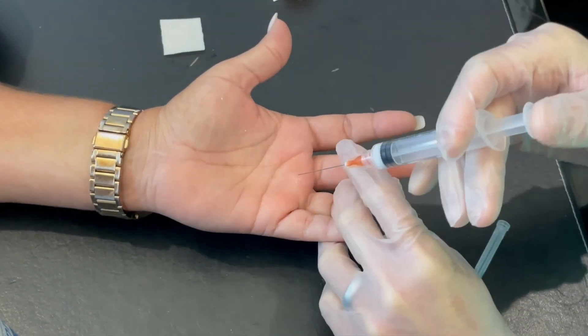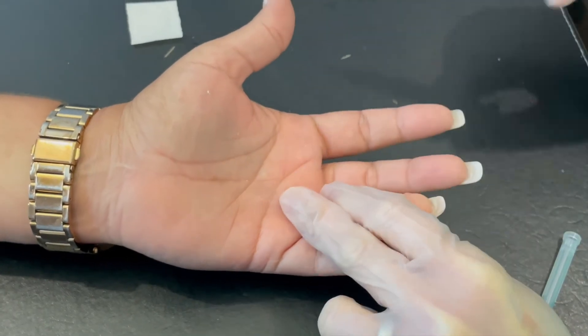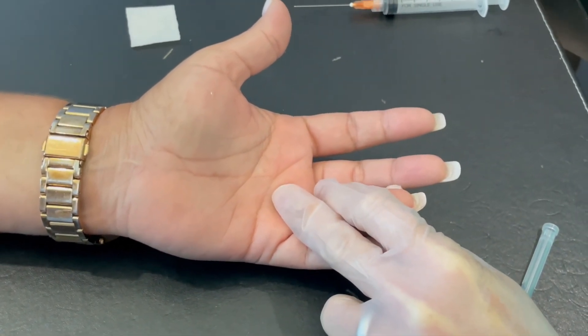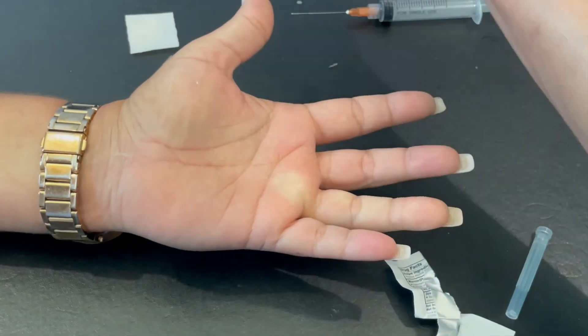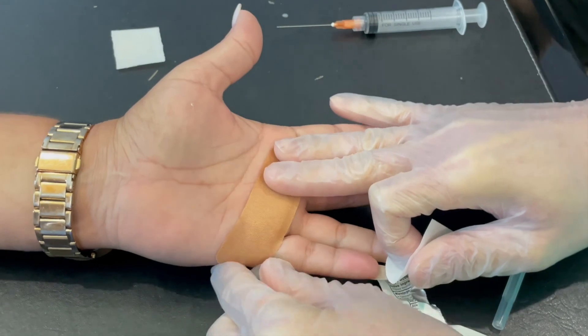We then inject 20 milligrams of Kenalog 40 milligrams per ml into the left ring finger using a 25-gauge needle. We place a band-aid to absorb any minor bleeding that might happen, and the patient is sent home at this point.